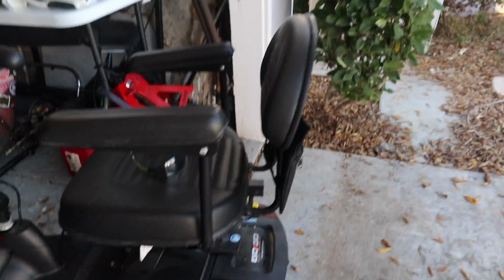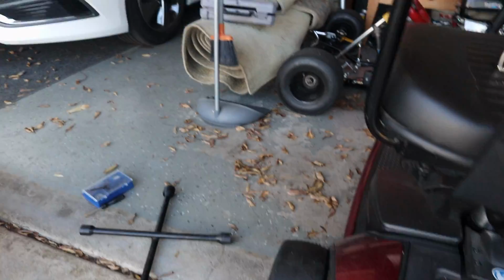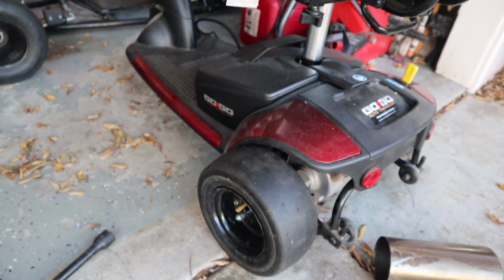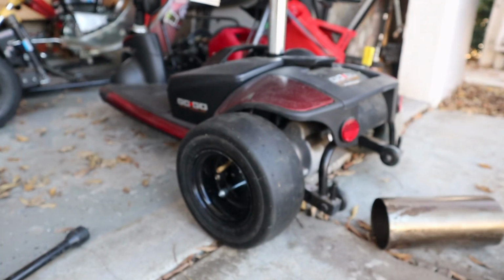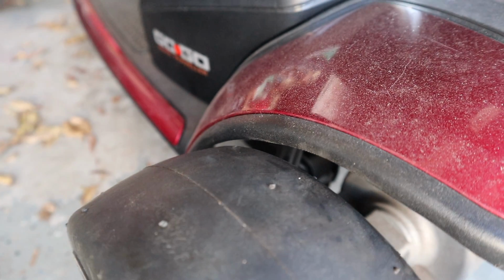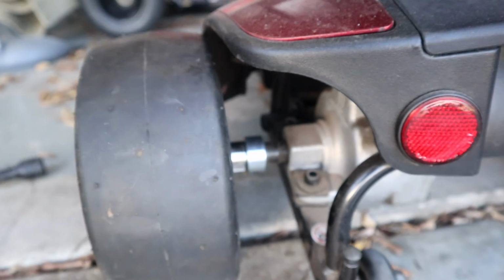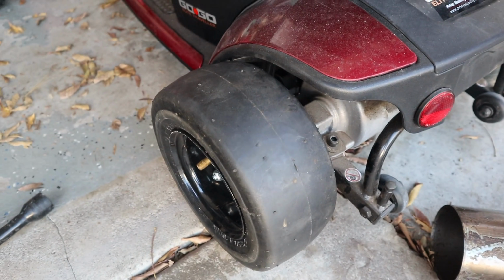So now that the wheel is on, you can go ahead and take it off the stand. Now we have the official go-kart wheel on the electric wheelchair, which just looks so crazy. My gosh. Wow. Fitment is on point too, because that clearance is just so mint. Wow. Honestly, super happy with how it came out.